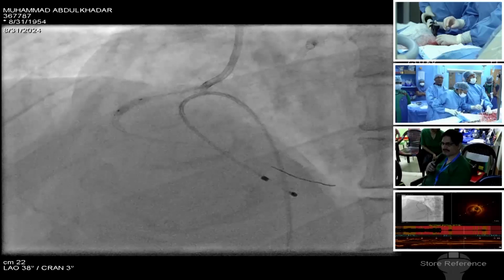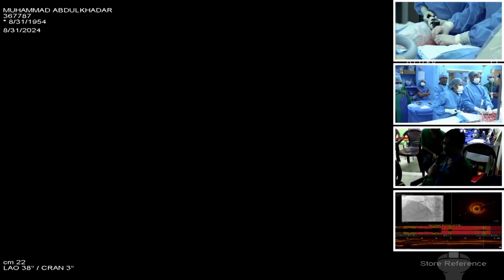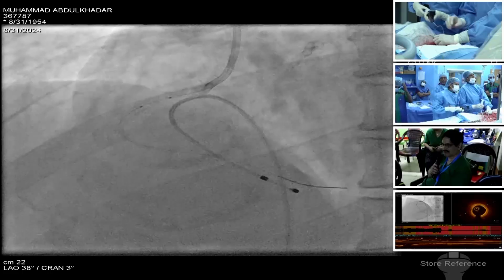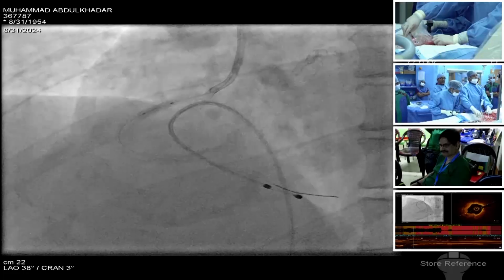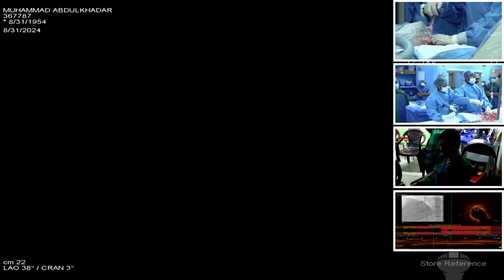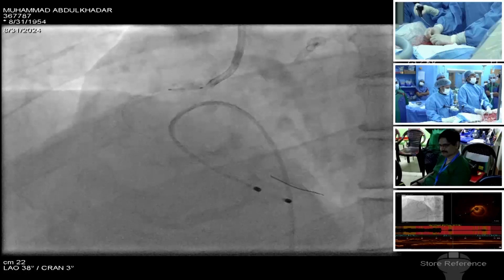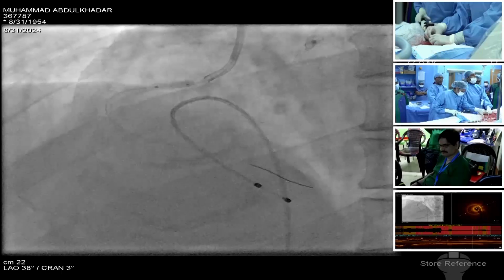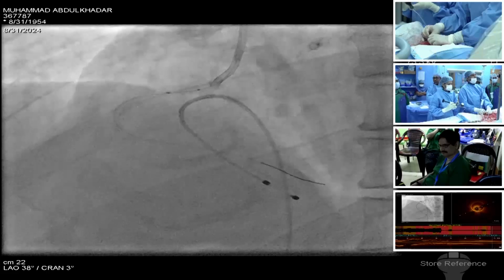Sir, your comments on that, Kapaji sir. That balloon is a 3 mm balloon. 3 mm balloon distally, and proximally we go with a 3.5 because the vessel size is almost 4. Yeah. Optimization. What you have to do. After that, 14, 16, 18. Yeah. Okay. Now give a 3.5 balloon.